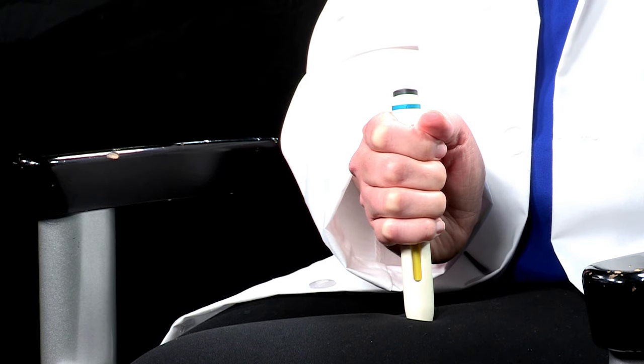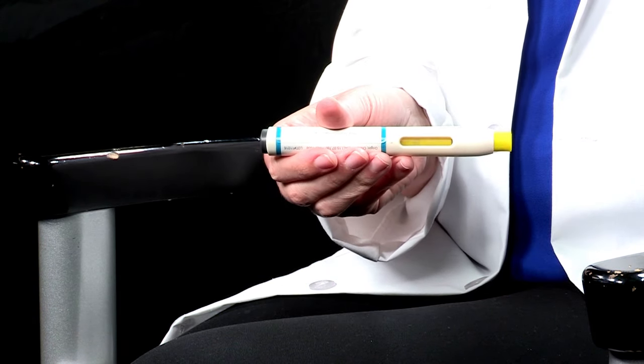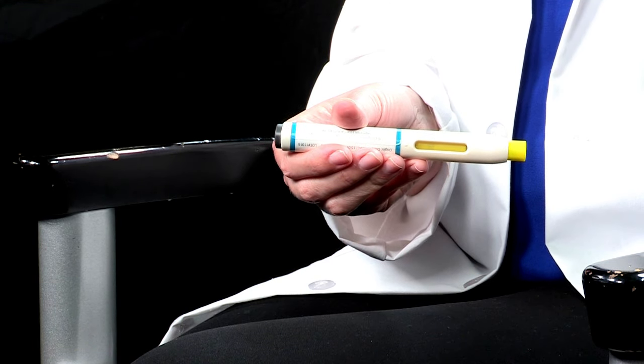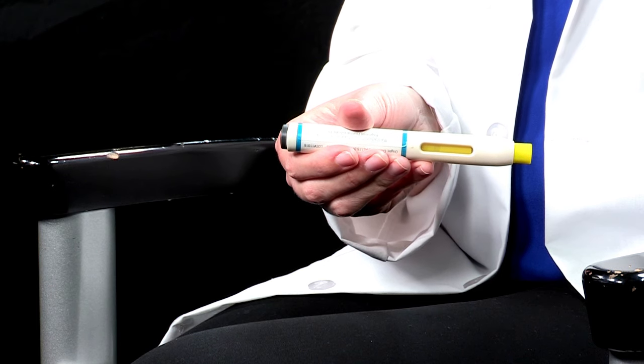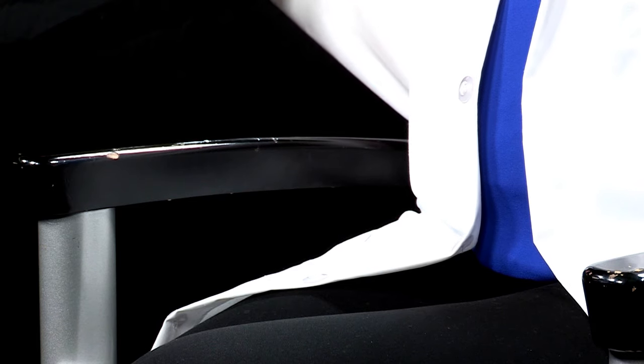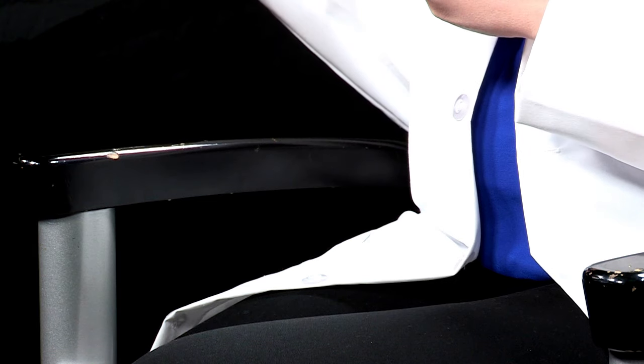Once the medication window is completely yellow, remove the autoinjector from your bare skin. If the medication window has not turned completely yellow, that means you have not received the full dose and should call your VA provider or pharmacist. After injecting, immediately discard the used Alirocumab autoinjector and blue cap into the sharps disposal container or empty liquid detergent bottle. Do not rub your skin after the injection. If you see any blood, press a cotton ball or gauze pad onto the site until the bleeding stops.